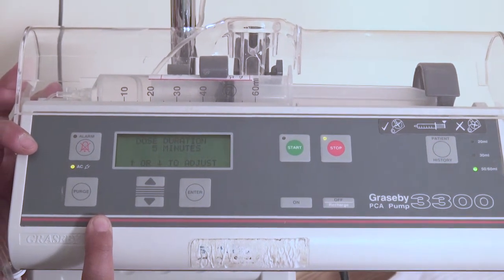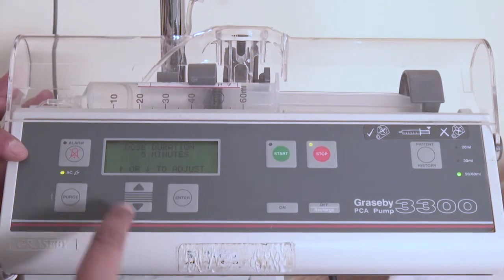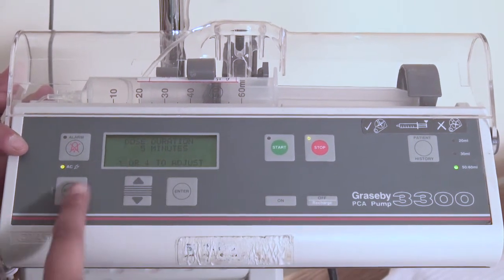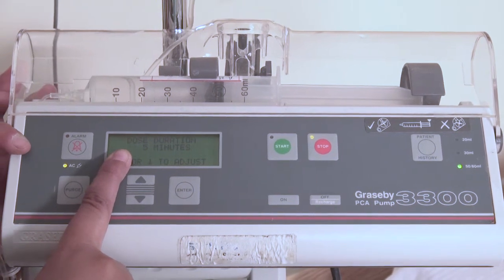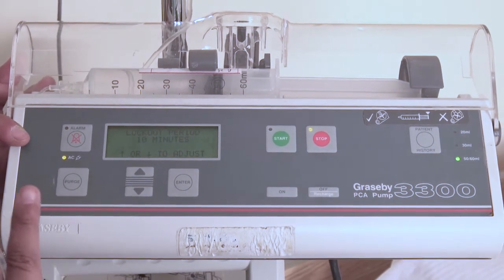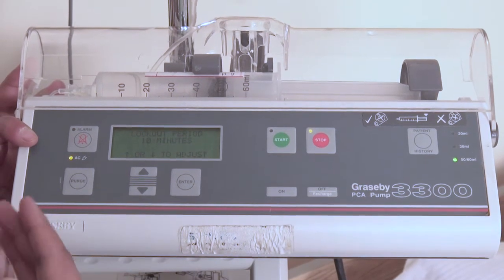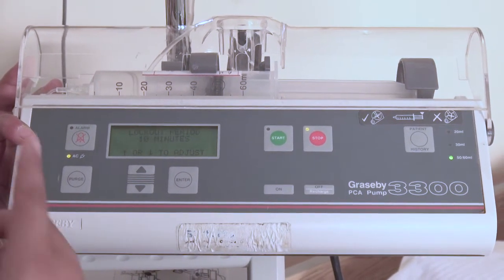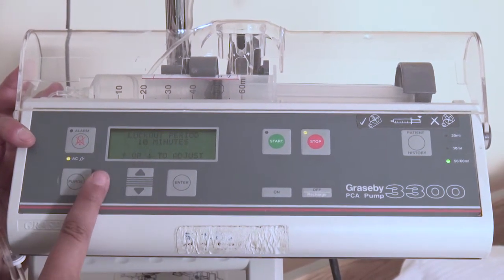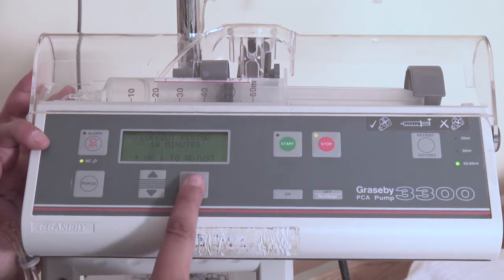My dose duration means how long this medication is going to be administered over. So he'll get 1 milligram of morphine over 5 minutes. Don't confuse the dose duration with the lockout. 5 minutes is fine, I'll leave it at that. Now I have my lockout period. Your lockout is the amount of time that must go by between the patient receiving another dose when pushing the button. They can push the button as many times as they want, but it'll only administer a dose based on the lockout time. That's 10 minutes, which is what the physicians ordered.